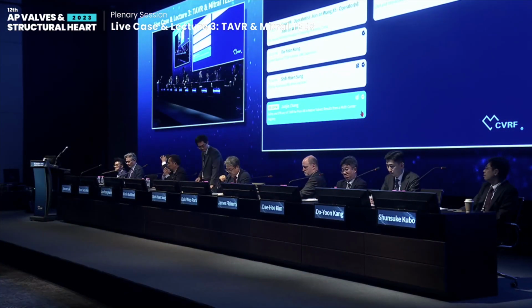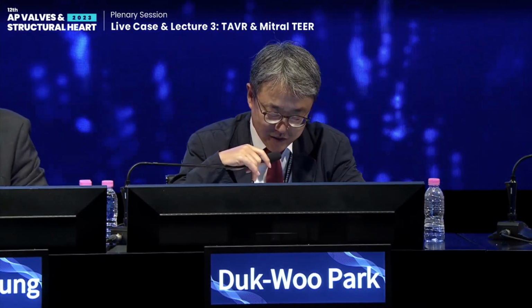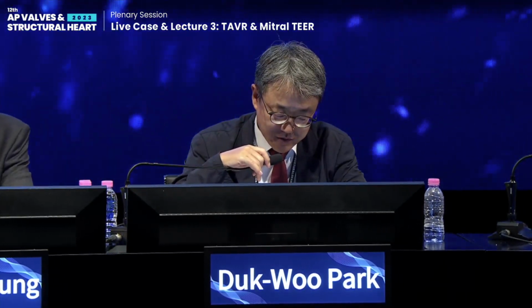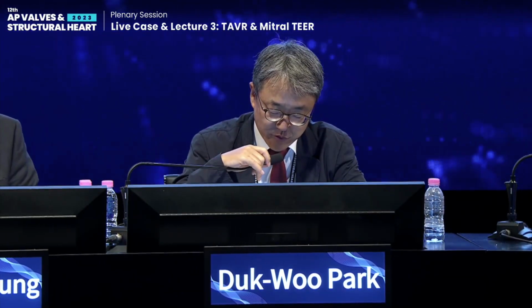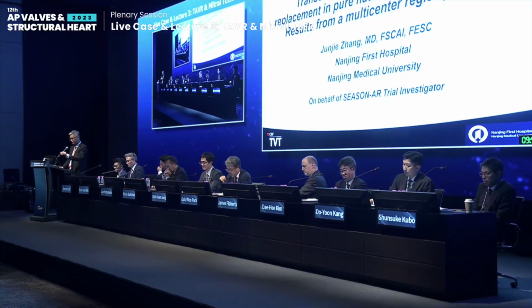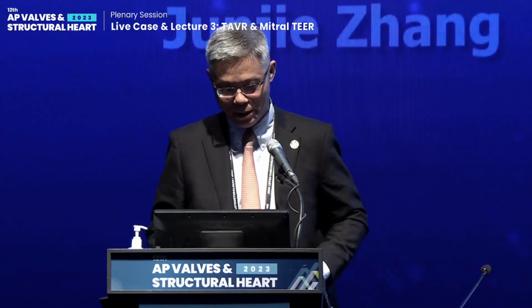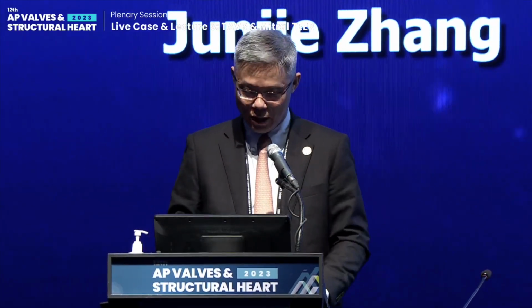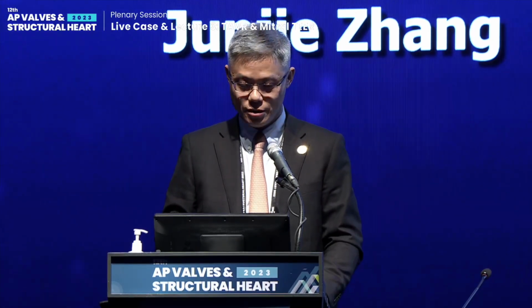Okay, we move to the last lecture, and Professor Junjie Zhang, welcome. The title is Safety and Efficacy of TAVR for Pure AR in Native Valve, Results from a Multi-center Registry. Okay, Junjie. Thank you very much for inviting me. It's my great honor to present our SEASON-AR trial on behalf of all the investigators.